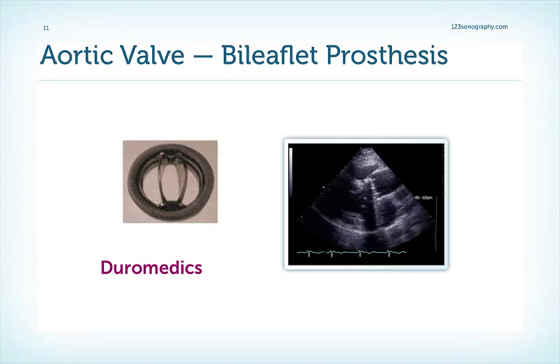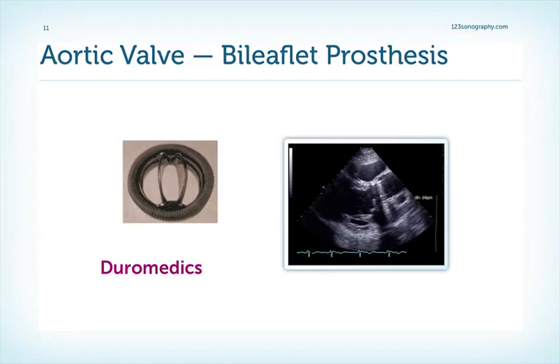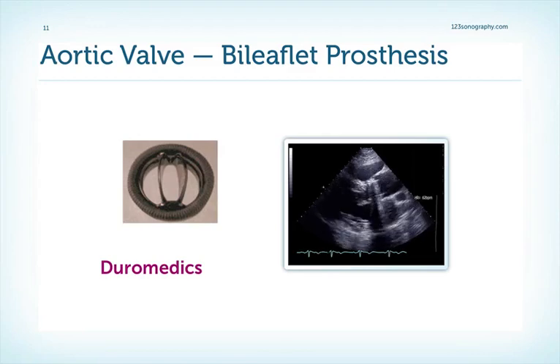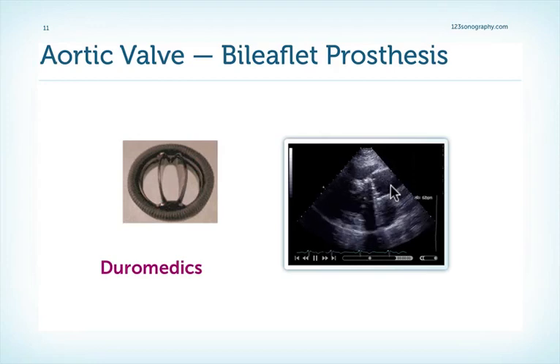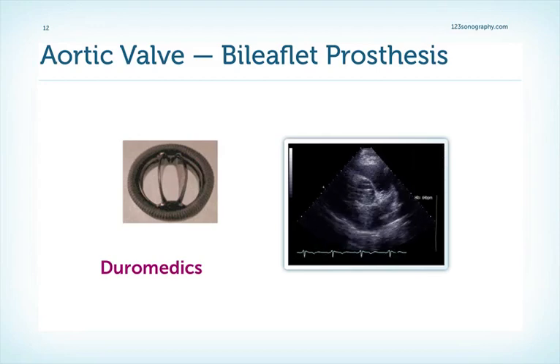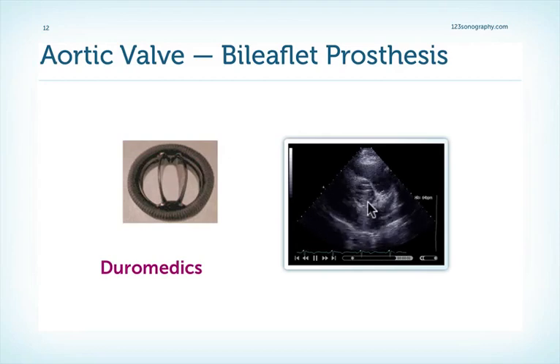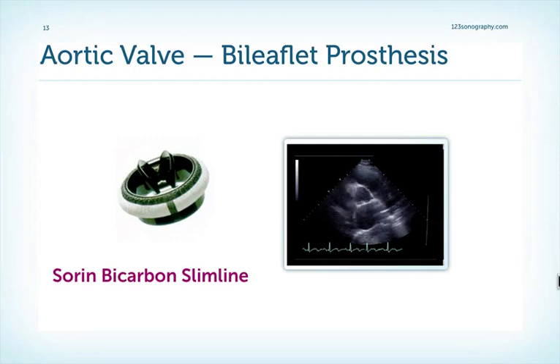Now let's turn to prosthetic valves in the aortic position. In general, it's quite easy to differentiate between biological and mechanical valves, but it's very difficult to say which mechanical valve we actually have. This is an example of a Duramedics bi-leaflet mechanical valve in the aortic position, as seen from a parasternal long axis view. All you can see here is a lot of shadowing, and those shadows also obscure the view to the prosthetic valve itself, so we cannot really see the leaflets.